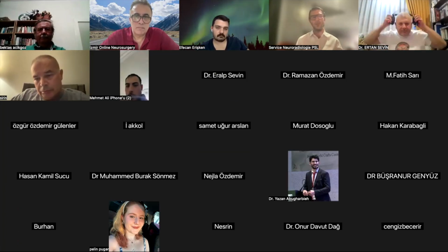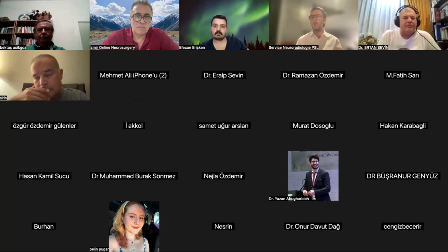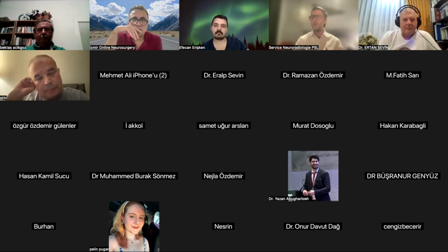So usually we treat 5 to 6 levels at the same time, especially in patients with osteoporotic fracture. You know, you have a lot of fractures, and no more than 5 or 6 vertebrae at the same time. So we do 2 procedures. If there are, I don't know, 10 lesions, we do 2 different procedures.